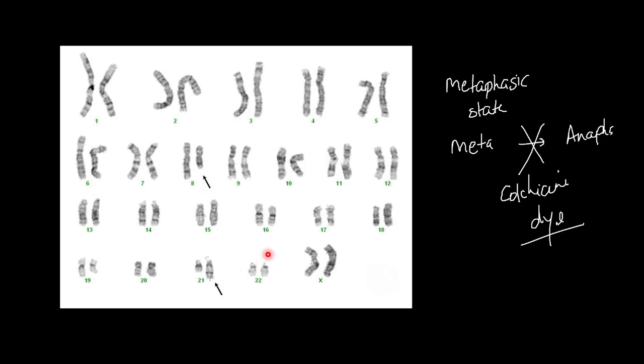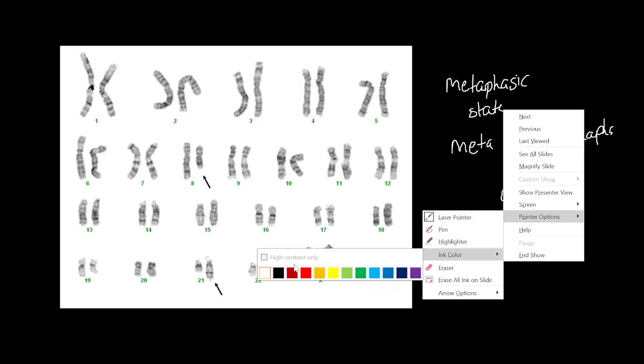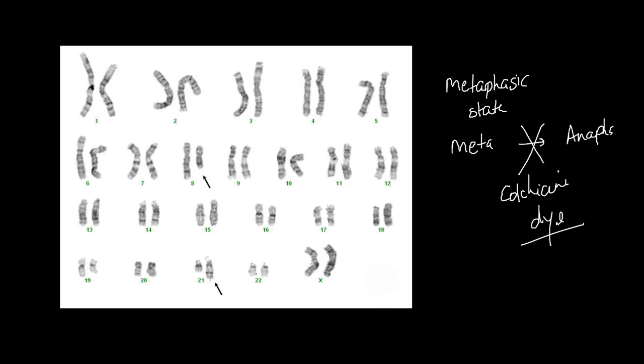If this is the condition, then it leads to acute myeloid leukemia, which is a blood cancer. So in karyotyping, the chromosomes are arranged in pairs. If there is a trisomy 21, you will get an extra chromosome here. Okay, so you can say this is the trisomy then.